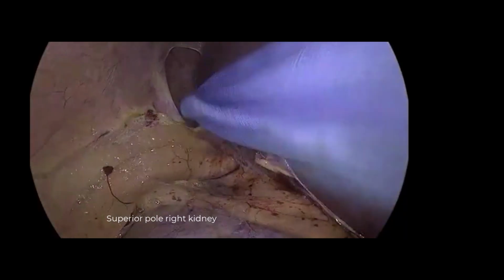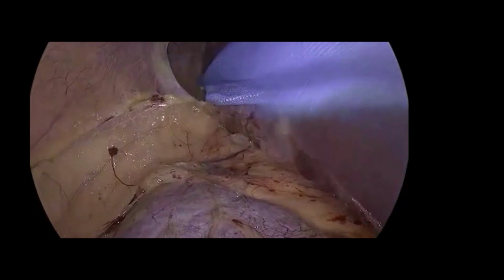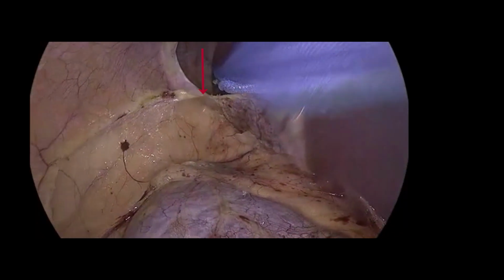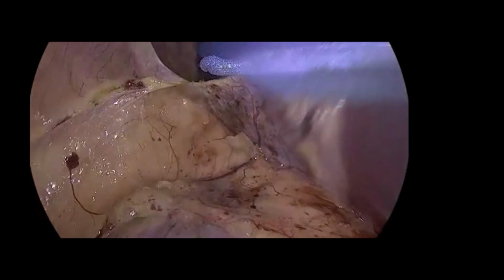Here's what I mean. This is on the right side. You can see the right kidney. You can see the paddle retractor is only partially deployed. You can also see they still need to complete opening the retroperitoneum for better visualization, and then they can move on to more fully deploy the paddle retractor.